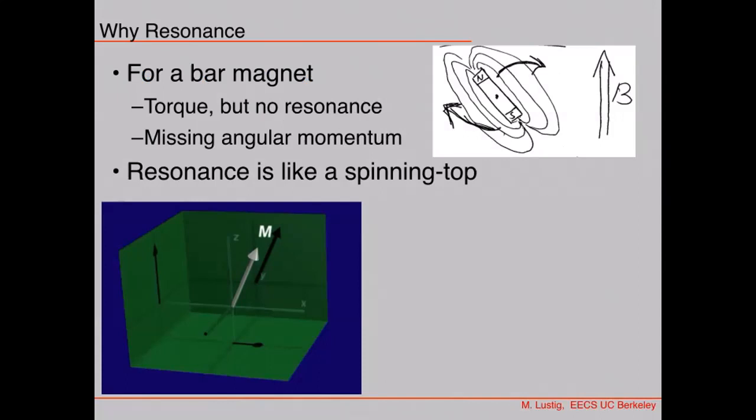A silly question, but how do you measure magnetic field in parts per million? I can imagine how you measure parts per million for a chemical that is in the air or something, but it's hard for me to imagine how you would measure the homogeneity of the magnetic field. Oh, so the magnetic field is accurate up to one millionth of a Tesla, one millionth of 3 Tesla at 3T. Are you moving something around inside the space to measure the homogeneity, or can you measure it from the outside?